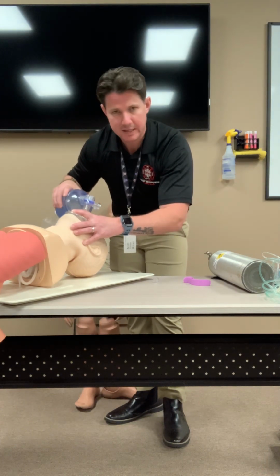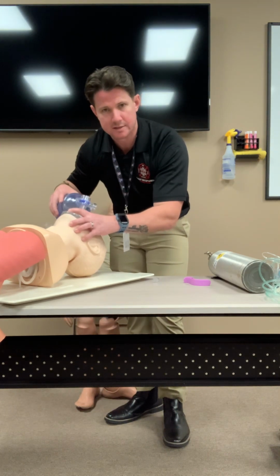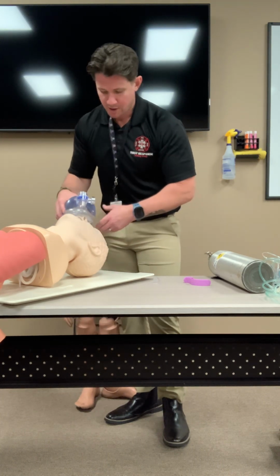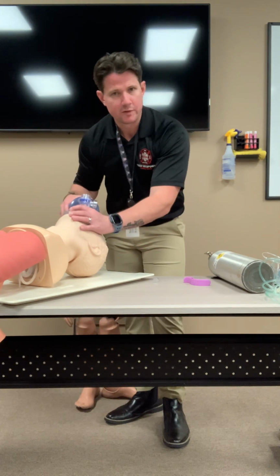But after about 30 seconds to a minute, I wanna make sure that I am on oxygen, right? Let's go with no more than 30 seconds that we're bagging. I wanna make sure that I'm on oxygen, right? So if you can do this right away too, if you choose to, right? But we wanna get some air moving in this guy.